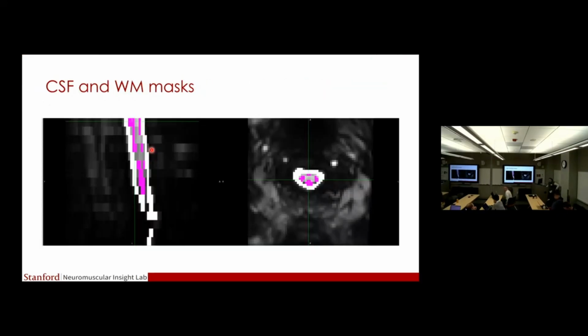Do you know anything from outside the spinal cord, outside the skin that we live in? The non-spinal mask can also be one of the reasons. I think we haven't implemented that in our pipeline yet. Gary, aren't you using the external or no? No, on CSF. I think Molly Bright's group.